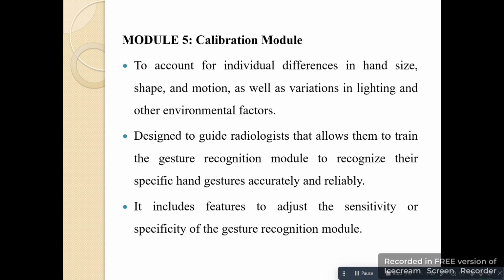Calibration module, to account for individual differences in hand size, shape, and motion, as well as variation in lighting and other environmental factors. Designed to guide radiologists, allowing them to train the gesture recognition module to recognize their specific hand gestures accurately and reliably. It includes features to adjust the sensitivity or specificity of the gesture recognition module.